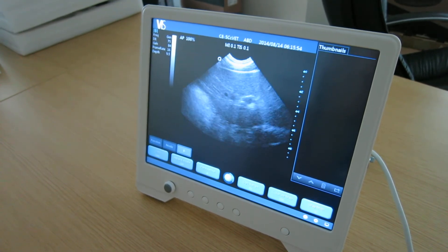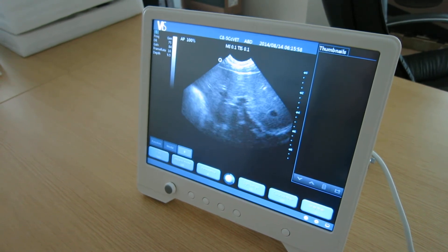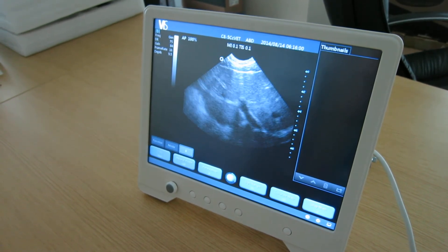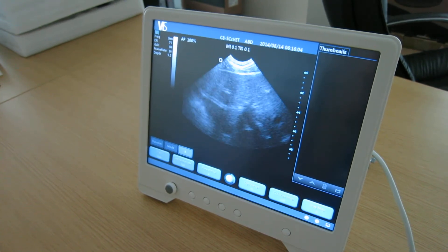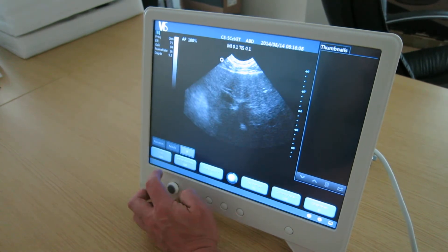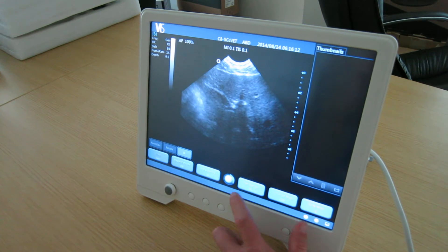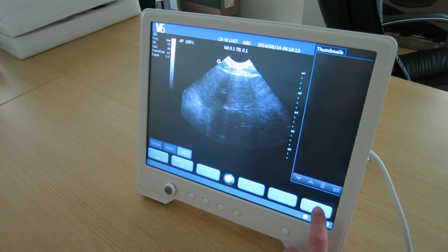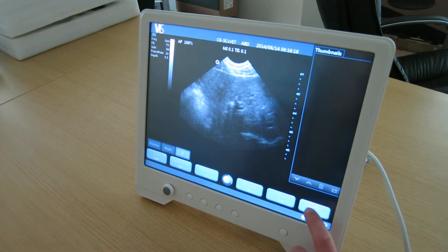So I'm scanning along and I can see good definition in the fluid within my liver structure, using a small-headed micro-convex probe. It has standard frequency settings, good persistence range, dynamic range, and grey mapping to be able to achieve the image you wish.